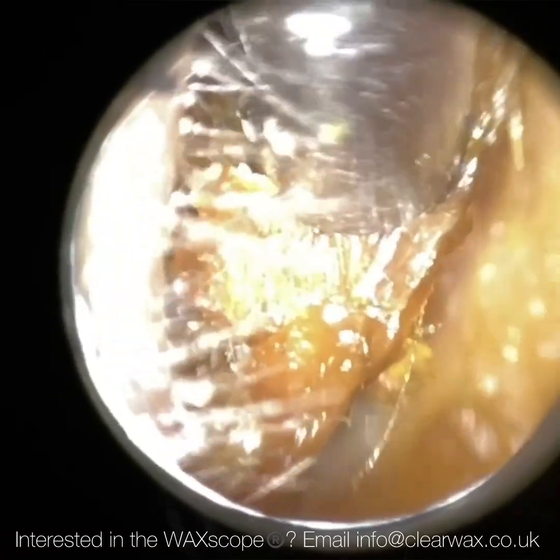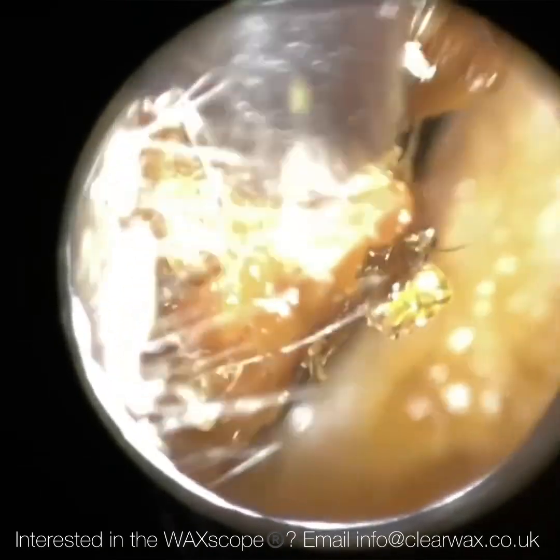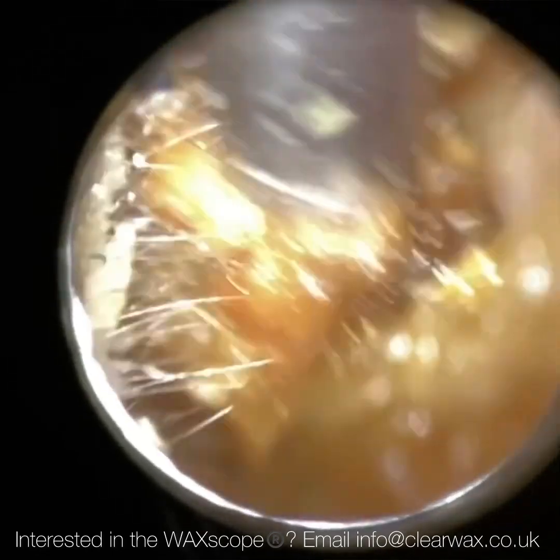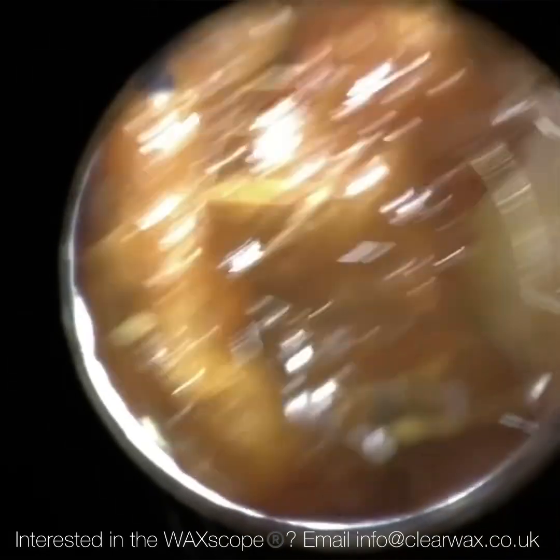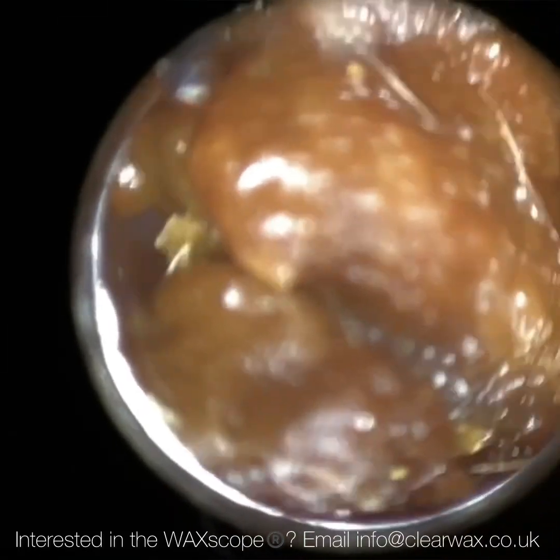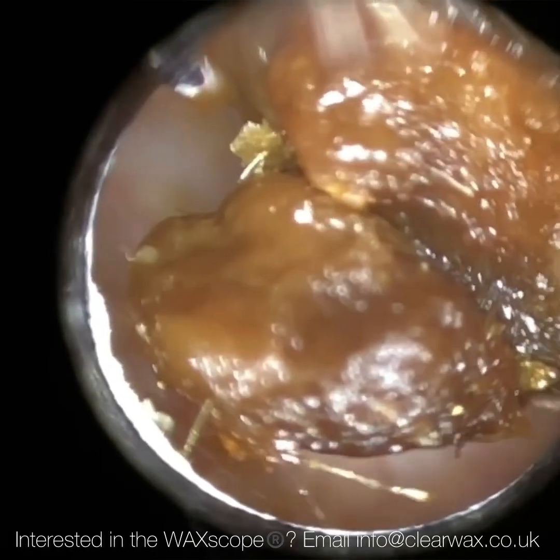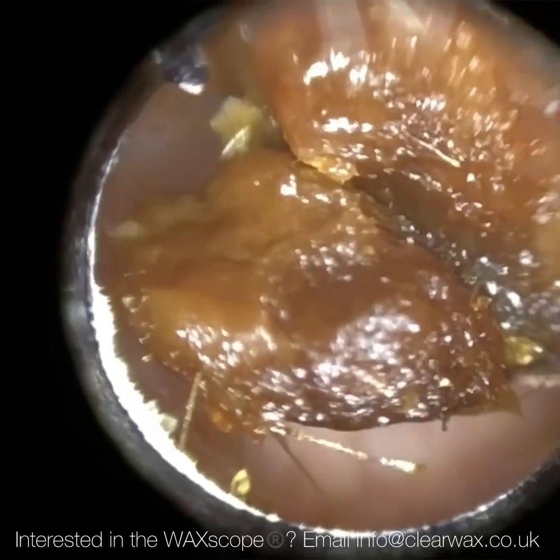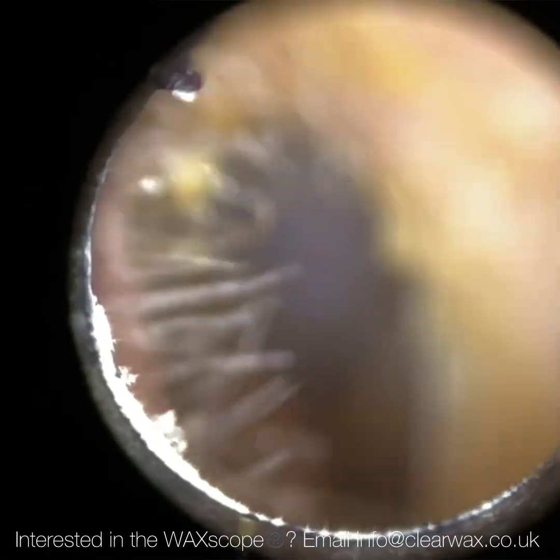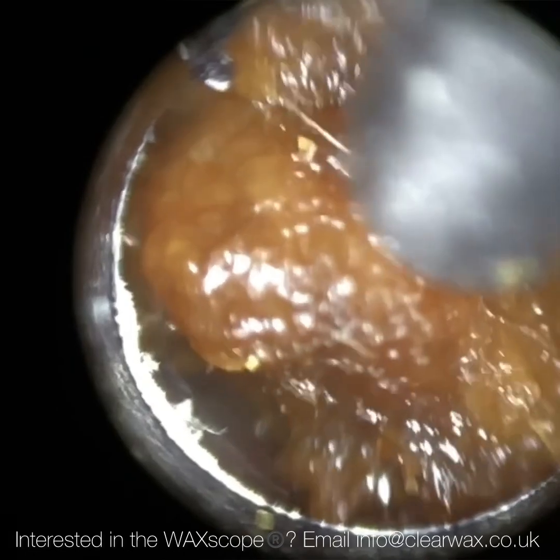I hope that little clip really hammers home the message and the rationale behind the development of the Waxscope, because if people can't use the endoscope, we don't want them resorting to suboptimal magnification like you just saw. We want them to have a very good alternative. Now, the Waxscope is an alternative to the endoscope, the iClearScope. It's not a substitute per se, so I'm not going to phase out the endoscope. I still use the endoscope for most procedures, although I've been using the Waxscope a lot more, obviously in preparation for its launch.